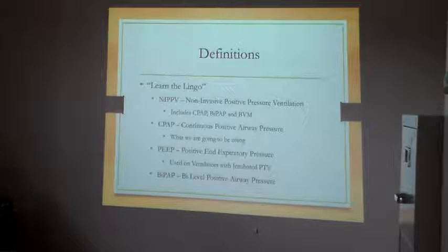And BiPAP is bi-level pressure. That means we're using 2 separate pressures to ventilate this patient. The thing about bi-level pressure is, it is expensive. BiPAPs are not cheap. And we're going to talk about the differences between the two here in just a second. Everybody good with it? All right.